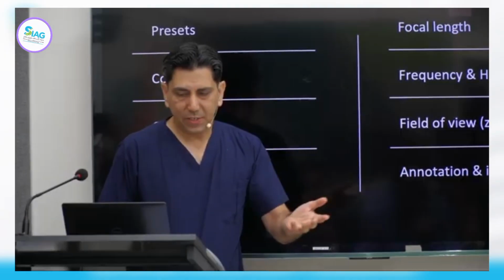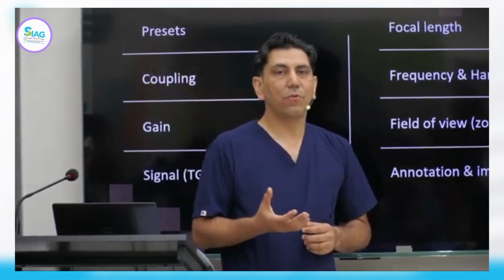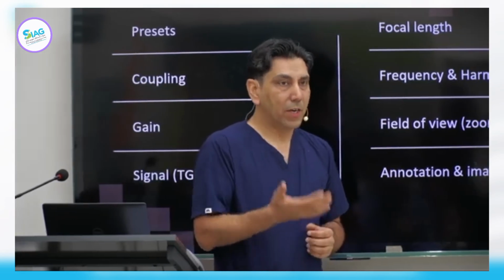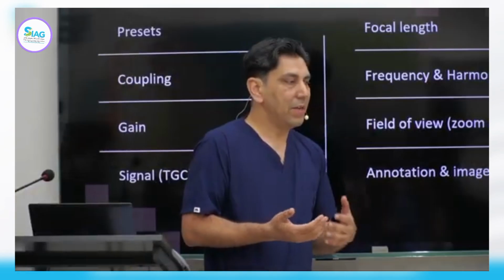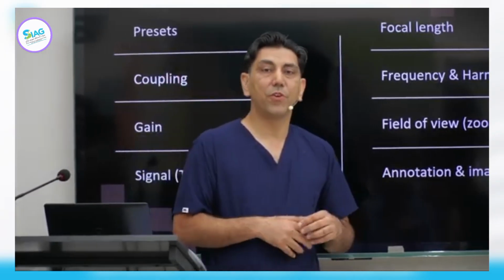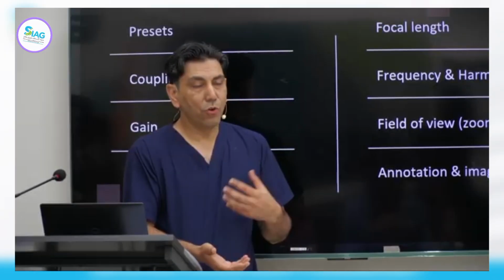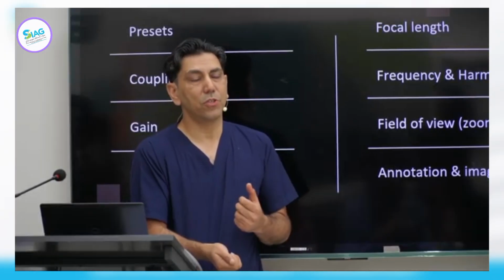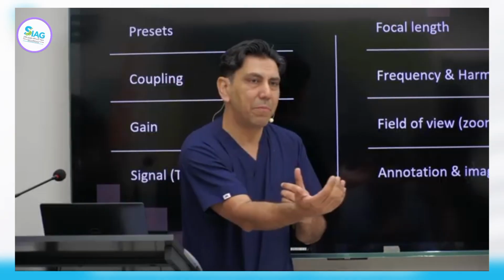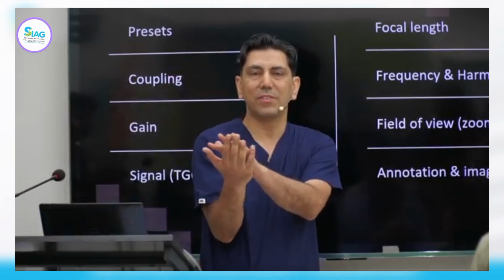Another important thing, obviously, as we discussed yesterday, is that air is the enemy of ultrasound. Therefore, throughout this examination, we want to maintain good coupling. Good coupling, less air. In some situations, however, you may have to introduce water, especially if you're in D2. Because again, in the case we had yesterday, if you're not using a balloon and you're trying to shorten the scope with the tip up, there's always a risk. The moment you try to relax, you just can't keep dragging the scope back. All you're doing is bringing the scope few folds together.